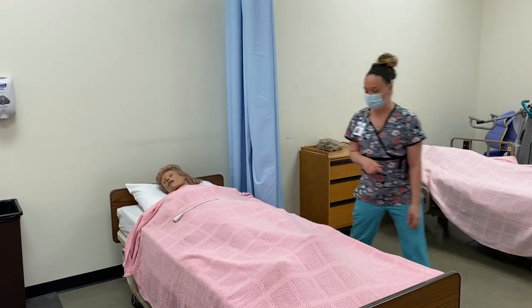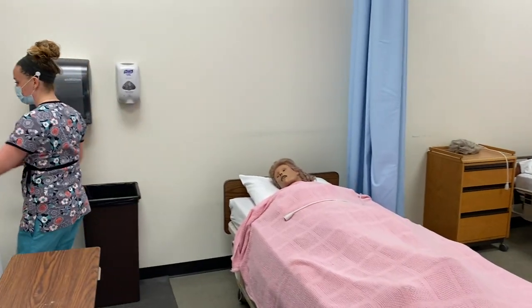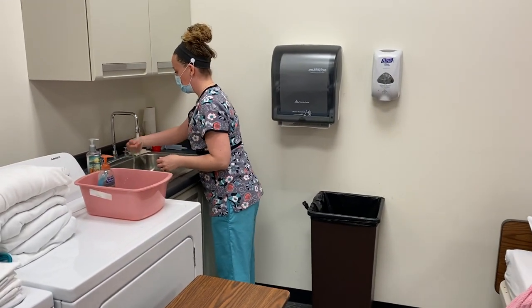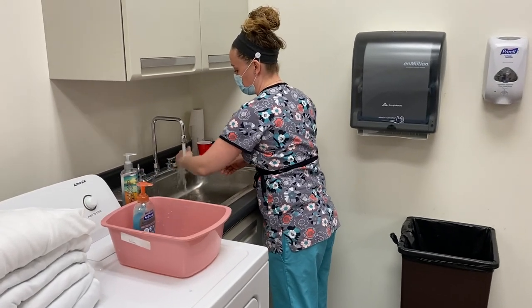I'm going to perform my hand hygiene now, making sure I get all areas of my hands and wrists wet.